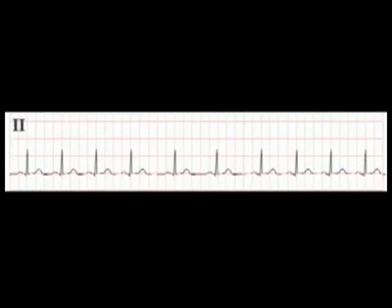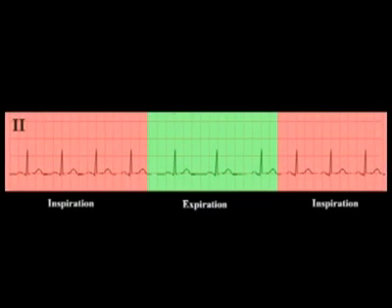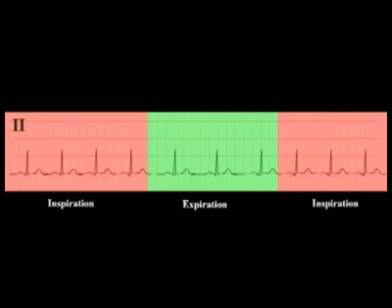In some cardiac arrhythmias the heartbeat is not regular. And in fact in many normal hearts, the heart rate is somewhat irregular due to a phenomenon termed sinus arrhythmia. You will remember from physiology that this is a completely normal variant, with the heart rate slowing during expiration and speeding up during inspiration. We cannot use the RR interval technique to calculate heart rate in this case.